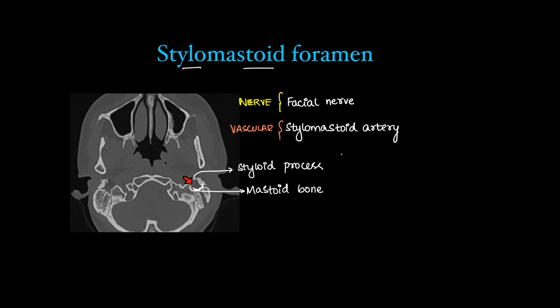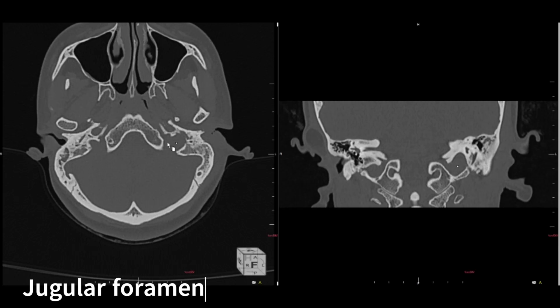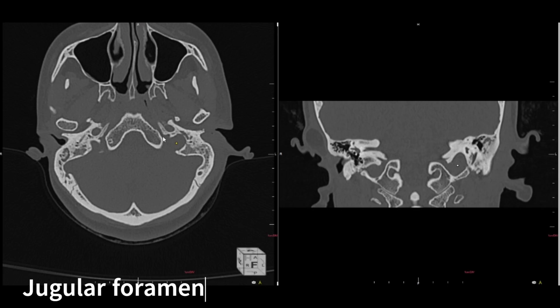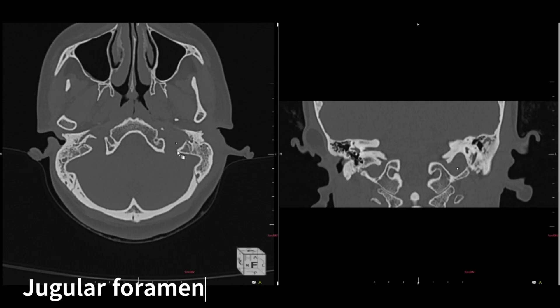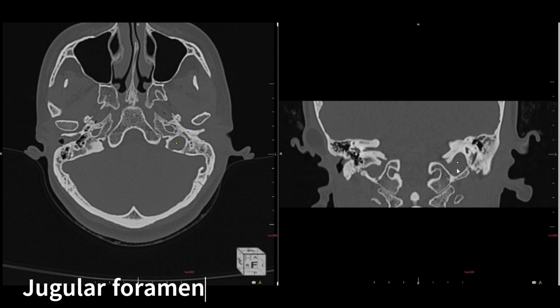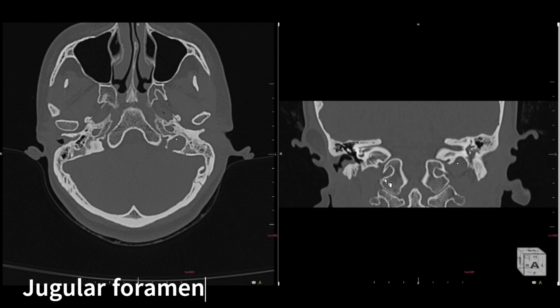Next is the jugular foramen — the bulbous foramen in the posterior cranial fossa. On coronal, it has two parts: an anterior part and a posterior part, divided by a bony prominence called the jugular spine. The anterior part is pars nervosa and the posterior part is pars vascularis. They are named for the structures passing through them. On coronal you can see where the jugular vein enters the neck.